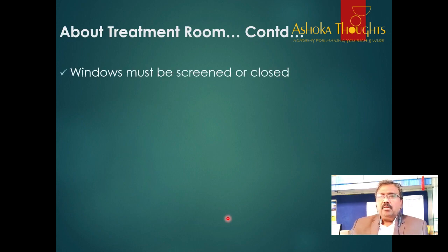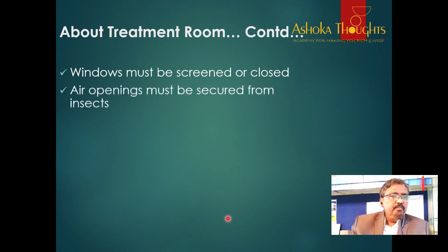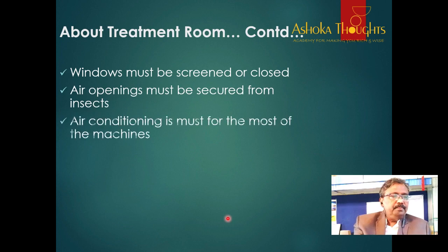Windows must be screened or closed. Obviously, the laser beam should not go out of the room. That's why the windows must be screened or closed. Air openings must be secured from insects. The insects should not come inside.